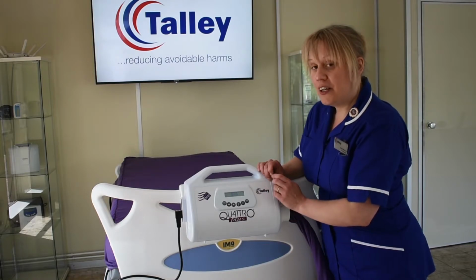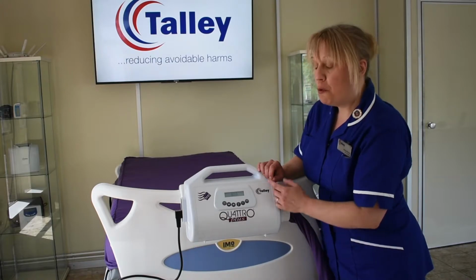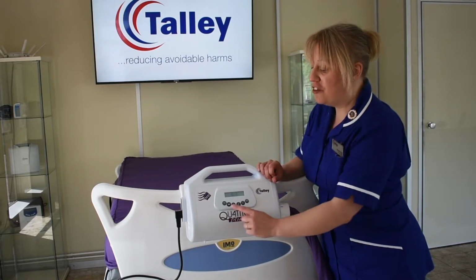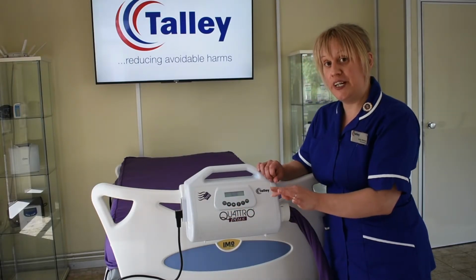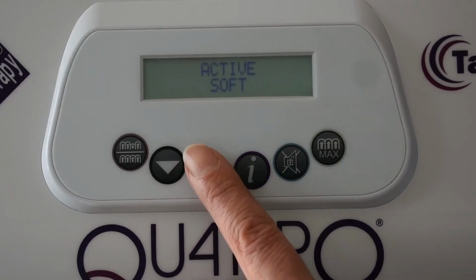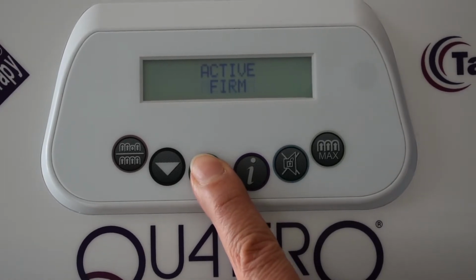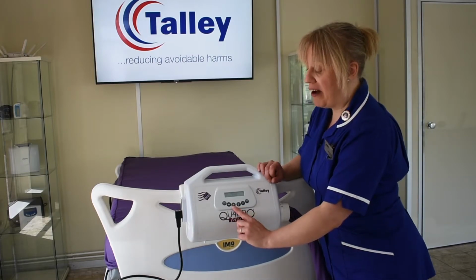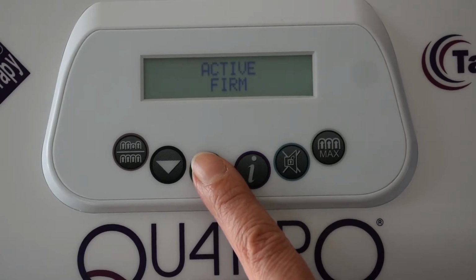So let's have a look at changing the comfort setting. Currently it's on medium. If we wanted to change the comfort setting according to our patient preference, then we just use our up and down arrows to do so. We have 3 comfort settings of soft, medium and firm. So we can come down to soft, and use the up arrow to go up to medium and up to firm. There is a 4th setting we can access by pressing the up arrow, and that's seated. If we press the up arrow past firm, it will go on to seated.